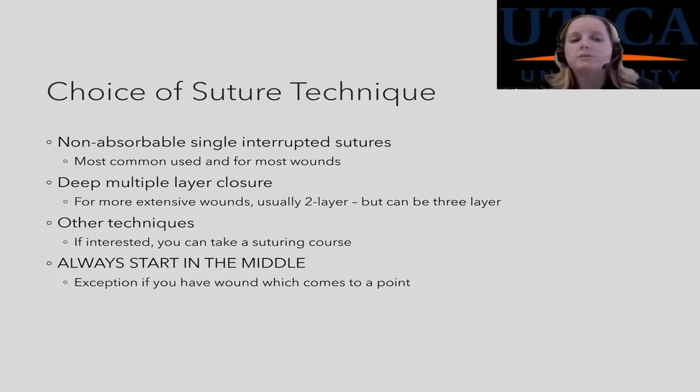The number one thing you should do is always start in the middle. Why? If you start at one end, you're going to end up crooked on the other end by the time you get there. I want you to practice that. Try starting at one end, and by the time you get to the other end, it's going to look crooked. Trust me. So start in the middle, put one suture in, and then do one side, and then do the other side.